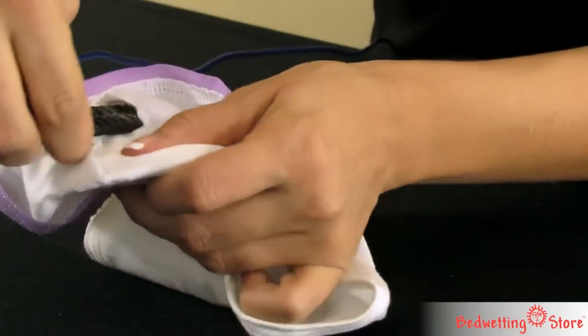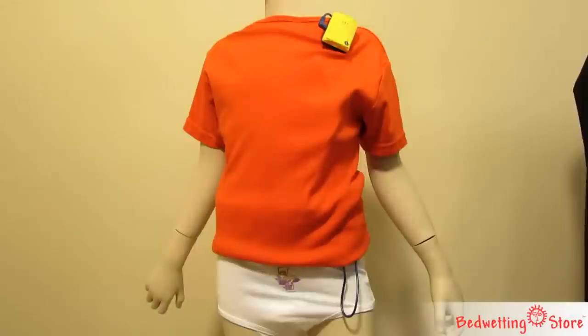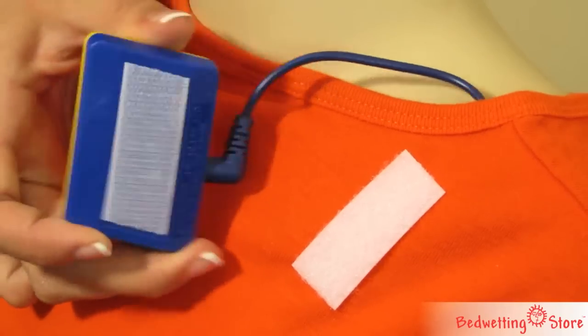Simply cut a slit and slide the EuroSensor into place. The alarm box is connected by a small wire and attaches to your child's top using a Velcro strip on the back.